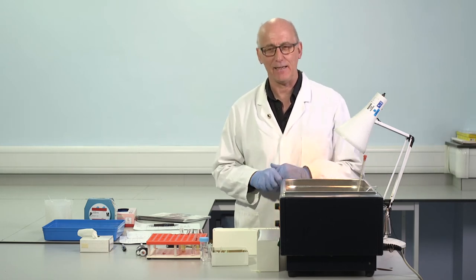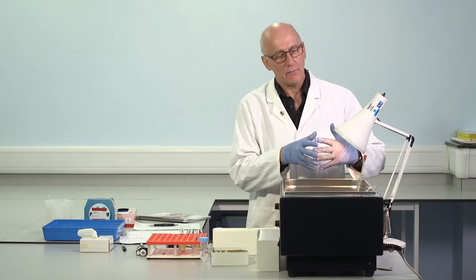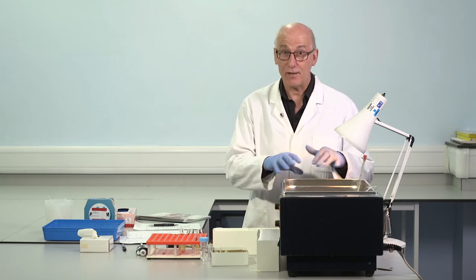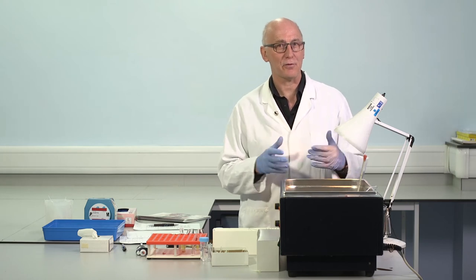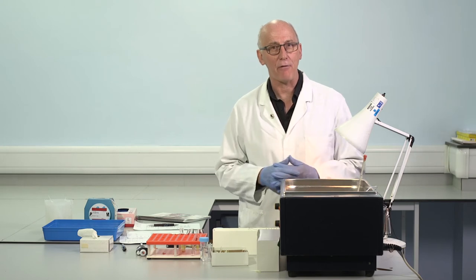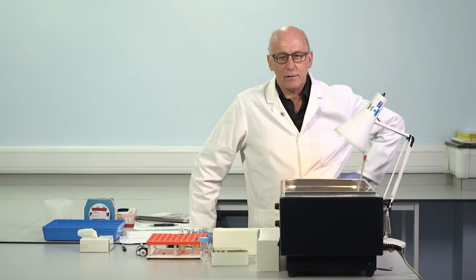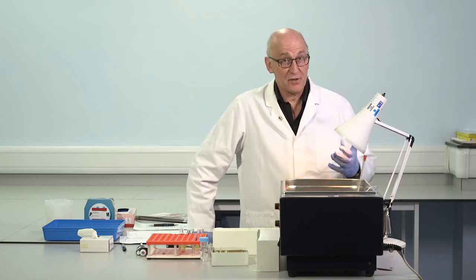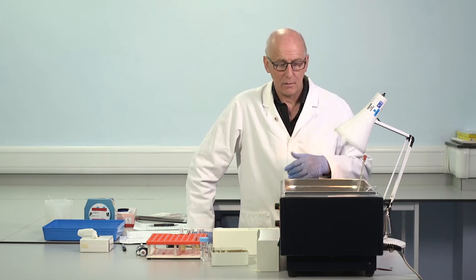So I think it's very useful to get some further information from APTT to make decisions that will shape our later investigations. These should, of course, be influenced by the patient's clinical picture. This is absolutely key, the bleeding history, absolutely key. But we can make some additional, fairly straightforward, relatively cheap tests at this point that will give us some important clues about the possible nature of the defects that might allow us to focus in on a particular area for further testing. So we know that we may be dealing here with deficiency, missing factor. We may be dealing with interference, inhibitors.